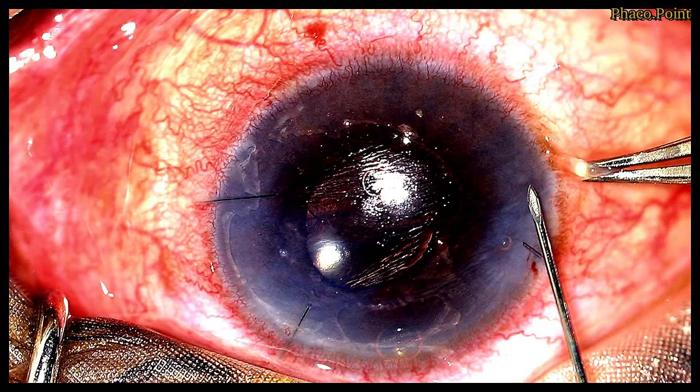We now move to the pneumatic desmetopexy. The first step is achieving good stability of the globe. I do so by holding on to the limbus with the help of a limbal forceps. Then I choose my point of injection — I always plan to inject the C3F8 in the area of clear cornea, that is, in an area completely devoid of any Descemet's membrane detachment.